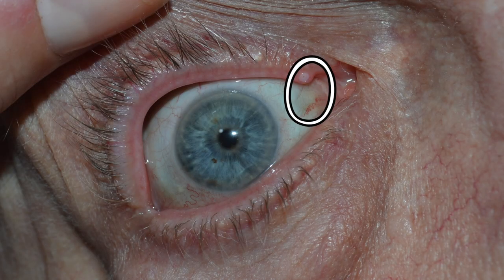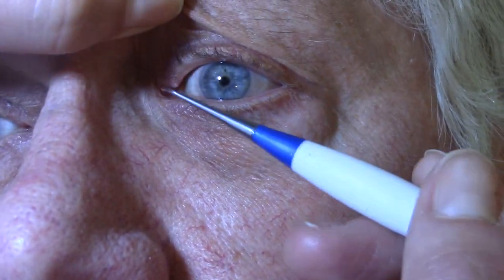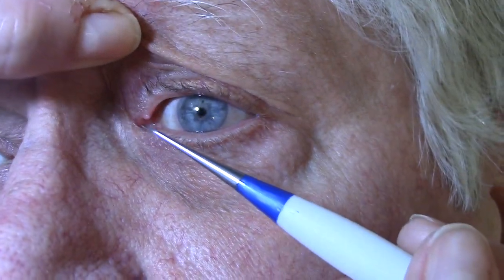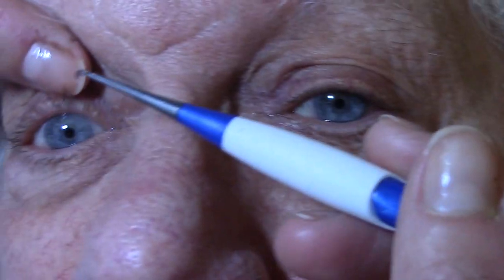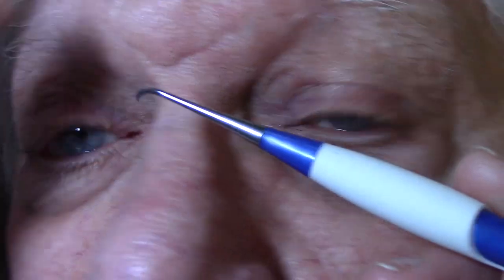They generally stay in but they can come out. The problem with this one on this eye is that I feel it's coming out because I can feel it in the eye. I can't feel the other three. As you can see, this one in the top of his left eye is just a little more prominent than this one over here.